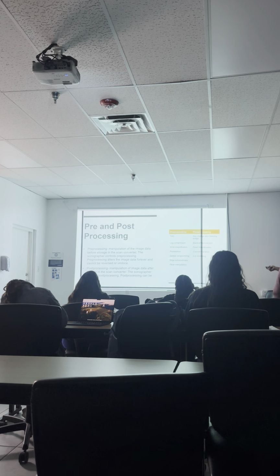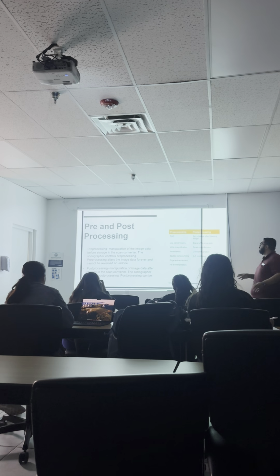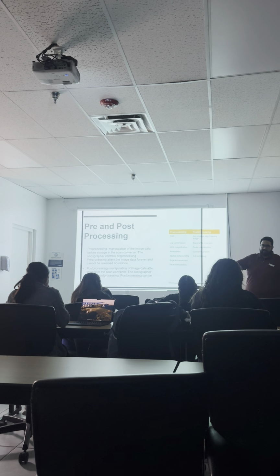Okay, spatial compounding? What does it mean to compound something? Different angles, like to put it all together? Yes, okay, so to put several things together. A compound is putting at least 2 things together to make one thing, right? So, what are we compounding when it comes to spatial compounding? The angles in space, right? So it's gonna take an angle coming this way, an angle coming this way, and an angle coming forward. It's gonna put them together to make one better image, okay?